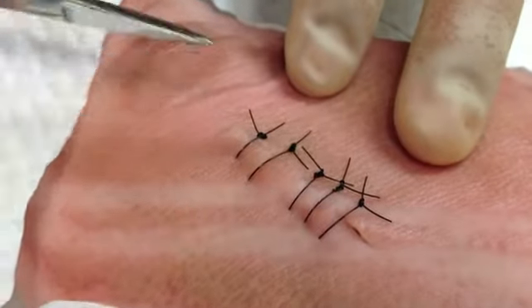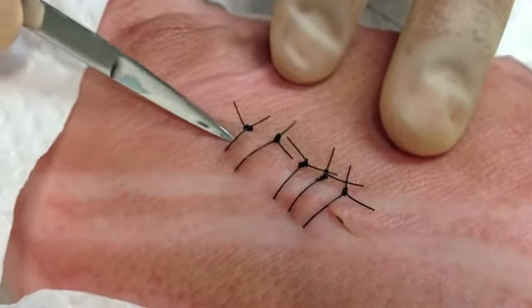So these are just 3 common mistakes that you want to think about to improve your simple interrupted suturing technique.